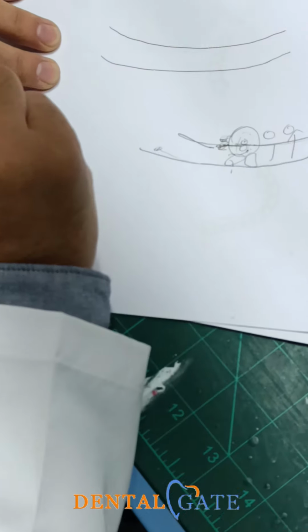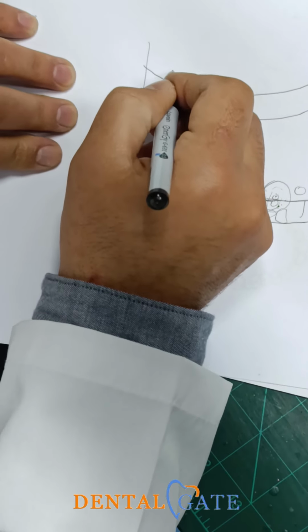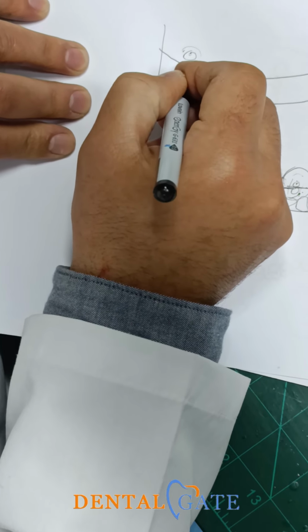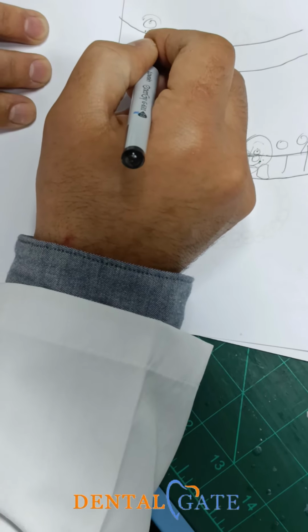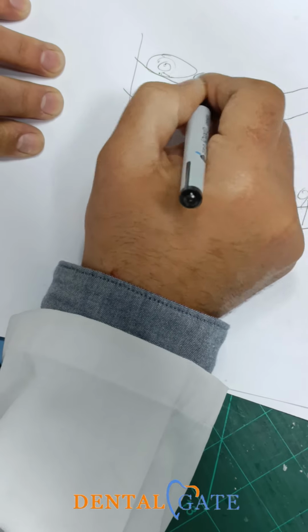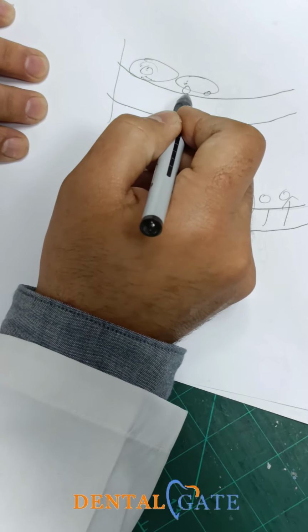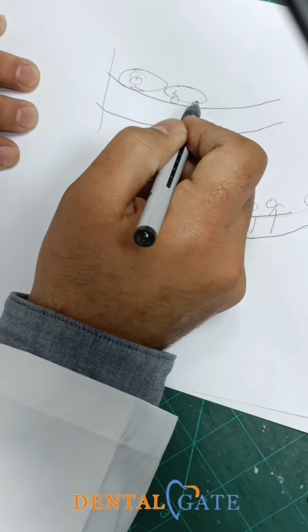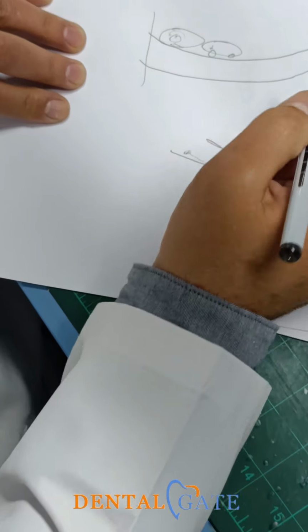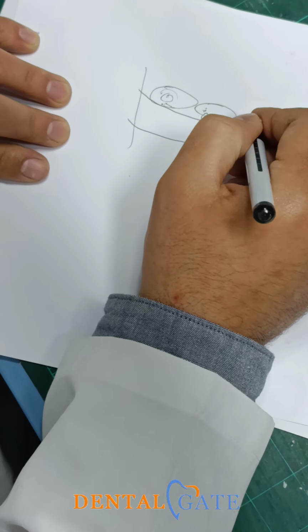Okay? The first premolar of the upper, this is the anterior tooth, okay? The contact area should be only at the lingual aspect, because this is the start of the curve, okay? The second one, both cusps should touch the table, because it is the neutral one, there is no curve here. It seems slightly concave, like a straight line in that curve. Sorry. The sixth one, the molar, we start with the severe curve.